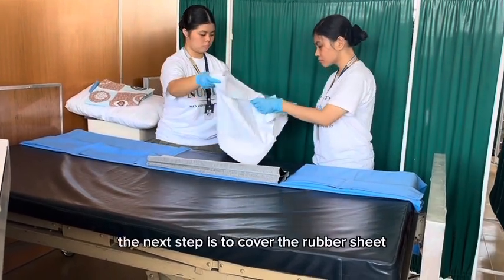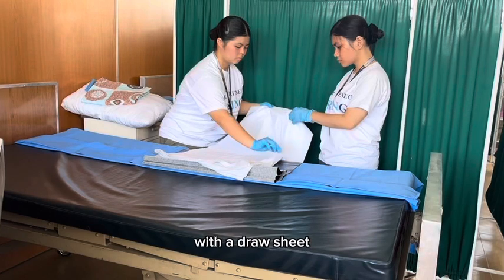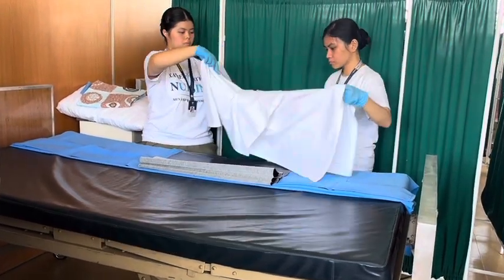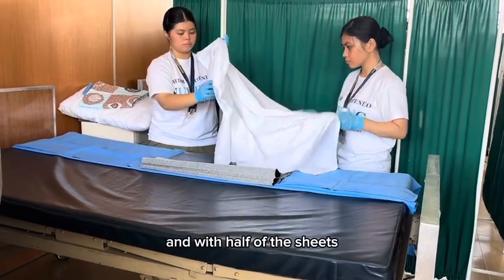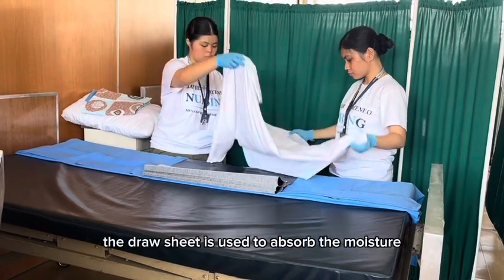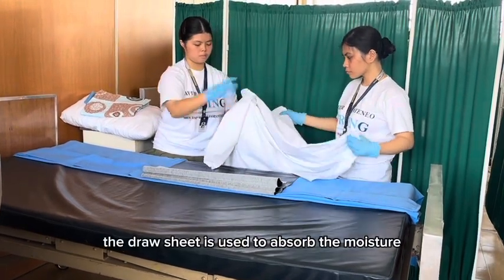The next step is to cover the rubber sheet with a draw sheet. The center fold of the draw sheet should be placed in the center of the bed, with half of the sheet fan folded towards the center. The draw sheet is used to absorb moisture.